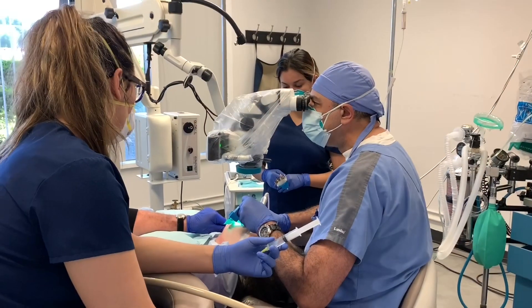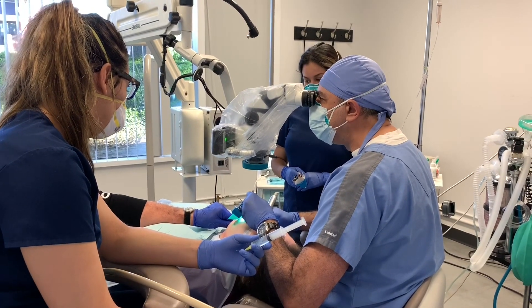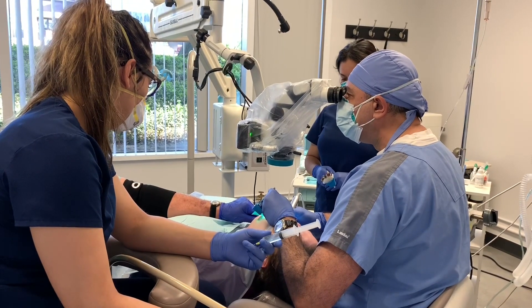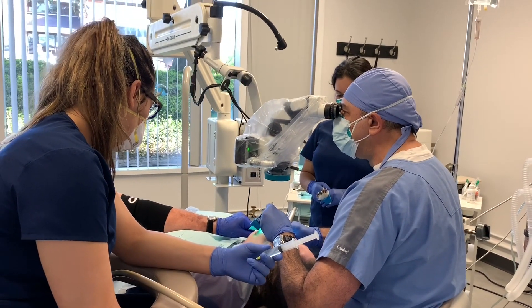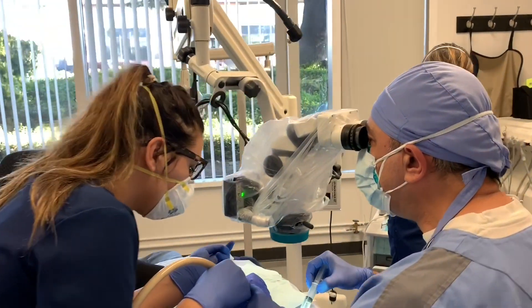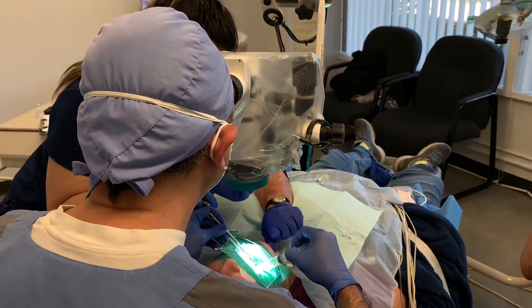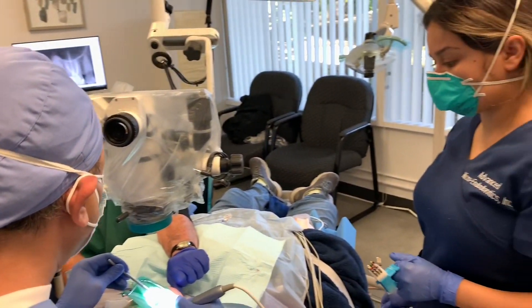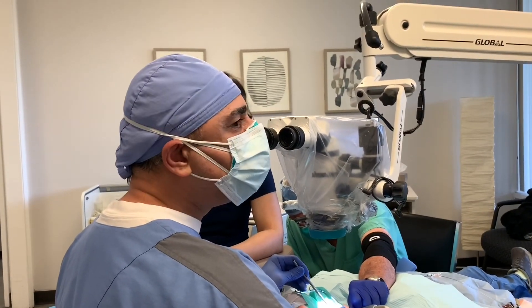I'm in MB2 and just brushing and brushing — I'm not going to take the C-file out, just brush the walls. With this 08 C-file I can taper and open up this very thin MB2 really nicely so my next file, the number 10, can go in easily. We irrigate after each file, and now my 10 C-file goes in easily because I used the 08 to brush the canal walls.